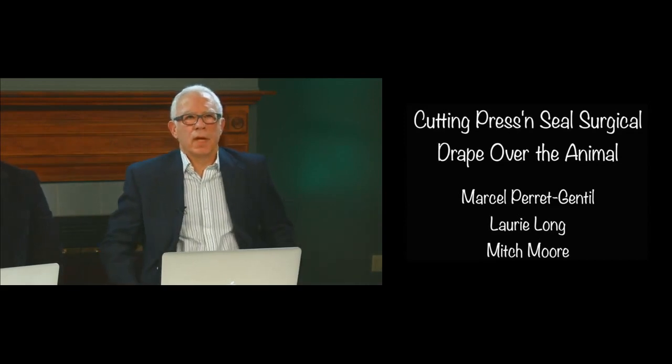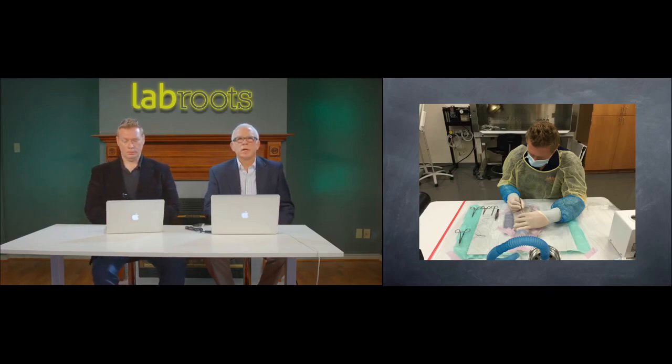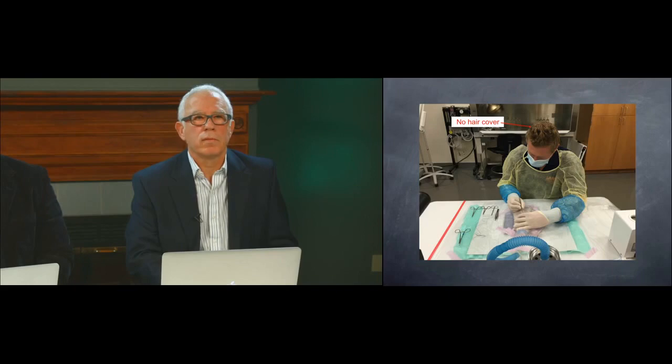So here's Mitch, okay? Some of these things that we're going to be looking at now are quite obvious. It is pretty obvious what's wrong here. However, all these slides I'm going to present to you, although it may seem obvious to you, it's what we see in these animal facilities and with these investigators in particular. So what's wrong with this image? I think you know it. He did not use any hair cover. He is likely to have particles fall right on the surgical field and contaminate the wound. So we're going to give this one a double face.